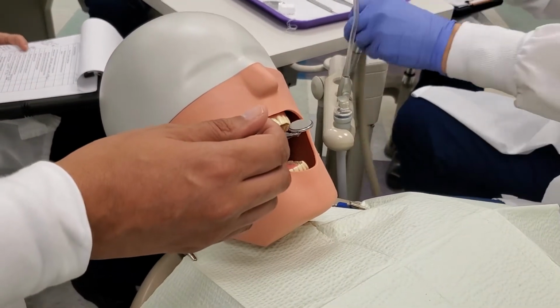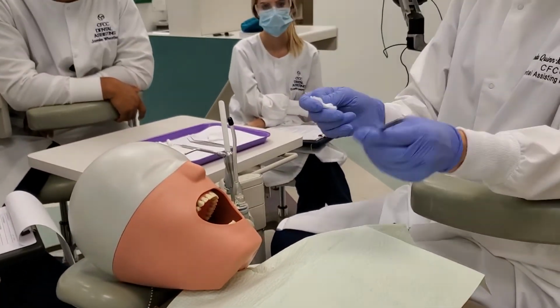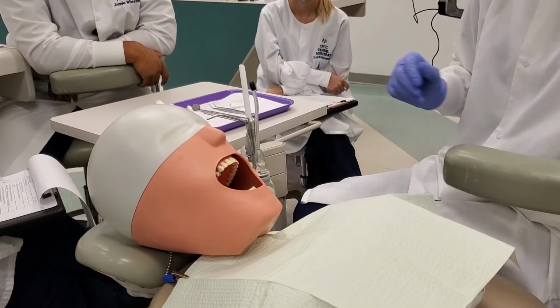Okay, so that's how you clean the mirror. And then sometimes, I mean, you may have like a 2x2 or something like that to wipe it clean. He'll just, whatever. But for this assessment, it's just the air water. Okay? That's how you clear the mirror.